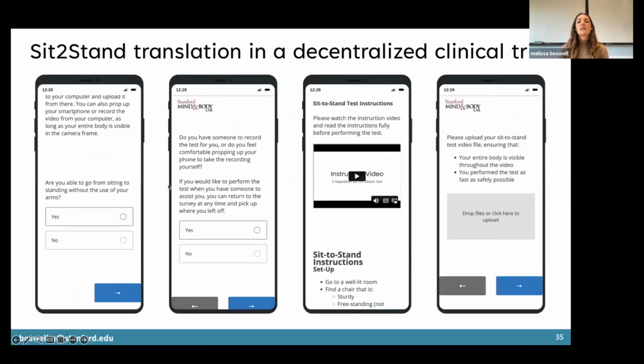And I'm doing this by taking our video and written instructions and just embedding them into the survey platform Qualtrics, which is the main platform for the study and digital intervention. And individuals upload the videos in that platform, and then I download them and can run them through our website or with the Python notebooks, which I'll share about next.